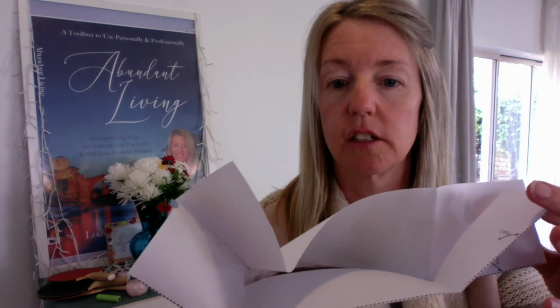With the cutting of the hair, they can then put it into this, which you've already pre-printed for them. There's fold lines you have to fold to make that so that it stays. Put the sellotape over there, and then you're going to go step 3 to post it off, so it's got the postal details on the forms.